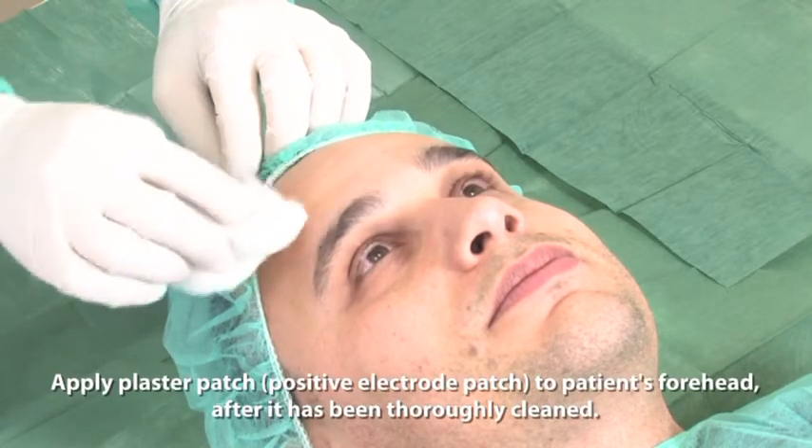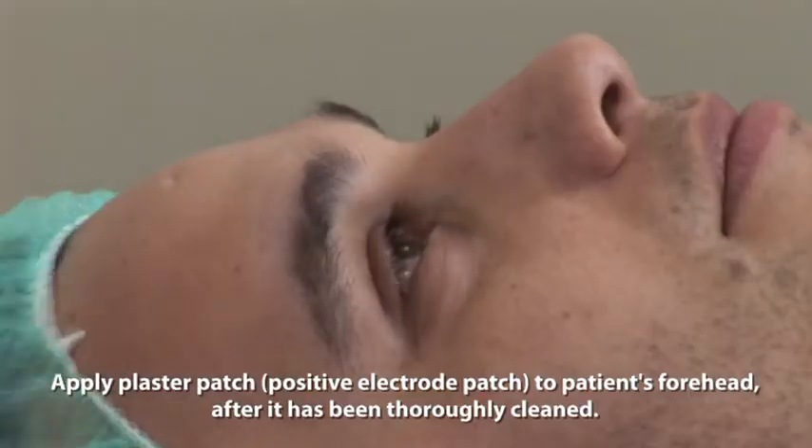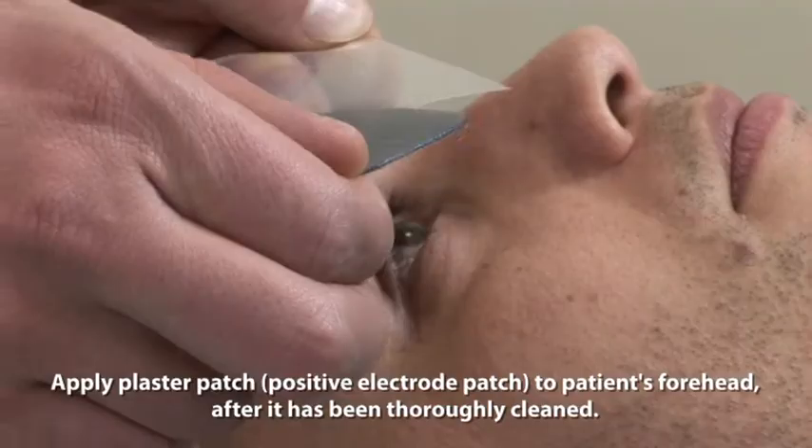Apply plaster patch — the positive electrode patch — to the patient's forehead, after it has been thoroughly cleaned.